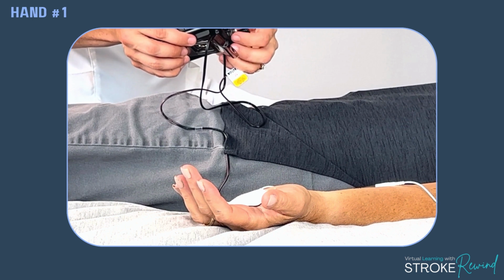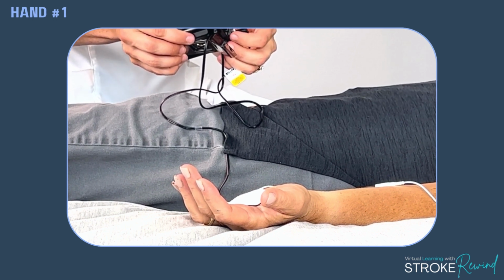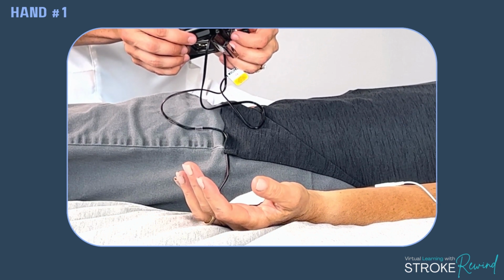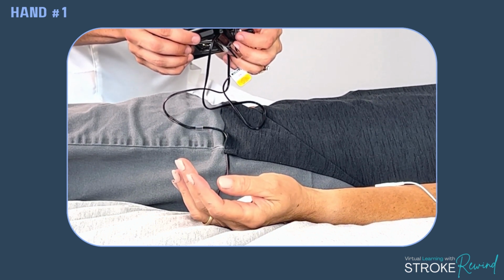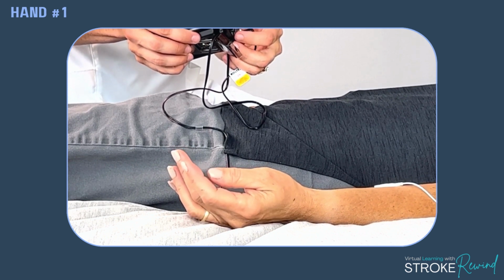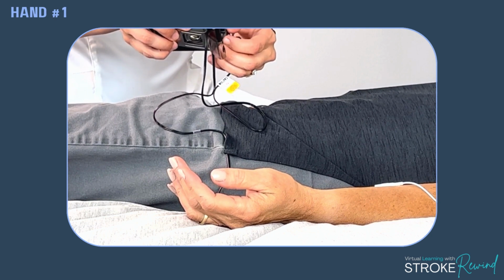Okay, I'm turning it on. Let me know when you feel it. I can feel it. Okay, now I'm going to look at that. Just getting some great movement. Her thumb's involved, her forearm's involved. As long as it doesn't hurt and it's not too much for her, then you're good to go.